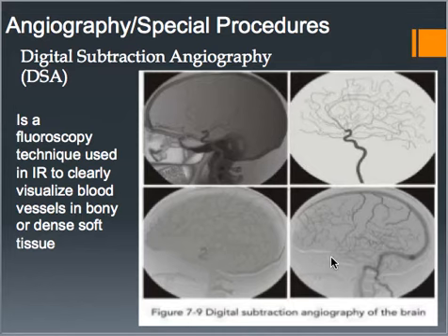And there's different levels of the subtraction here and here. You can see where you can still kind of see some of the soft tissue in the outline, but this one is completely subtracted.